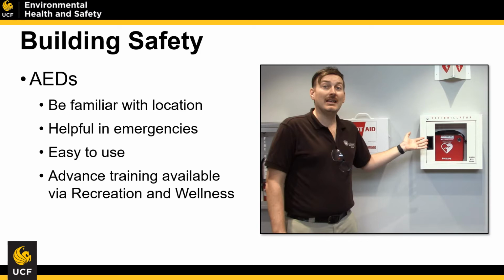Advanced training for AED usage can be provided to you by the Rec and Wellness Center through their AED and first aid and CPR classes. I encourage you to take advantage of this because it's an awesome resource available to you. AEDs are easy to use. The instructions within the unit will walk you through when you go to use them.